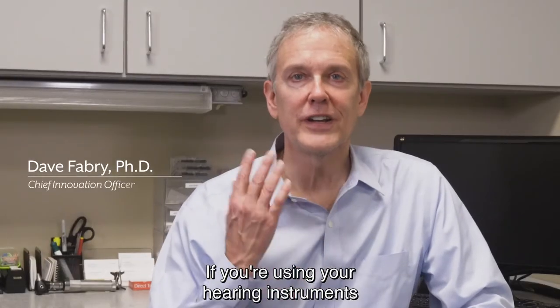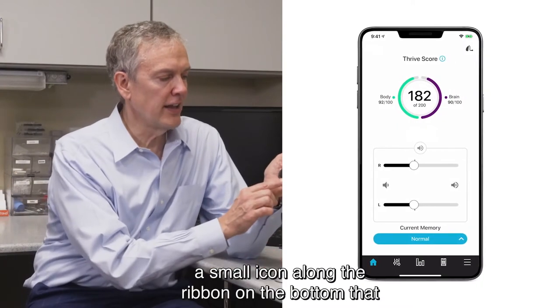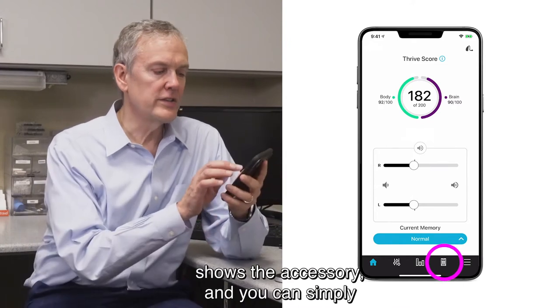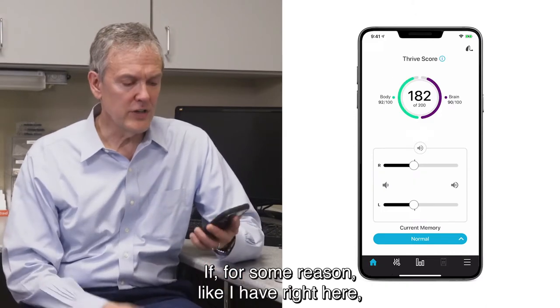If you're using your hearing instruments with an accessory like the table mic, within the Thrive app there's a small icon along the ribbon on the bottom that shows the accessory, and you can simply turn it on from that screen by pressing on the arrow button.